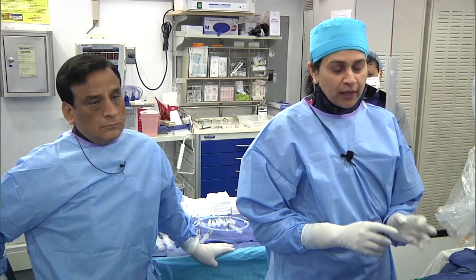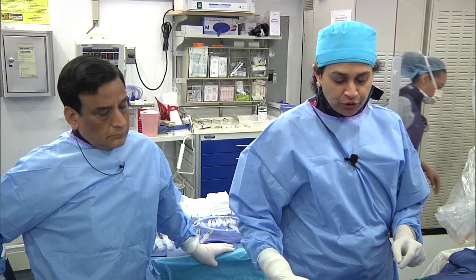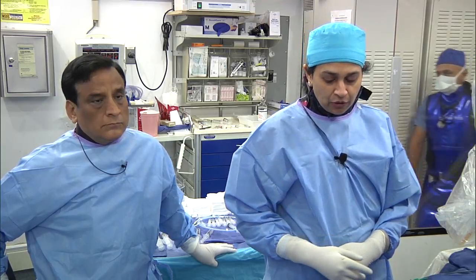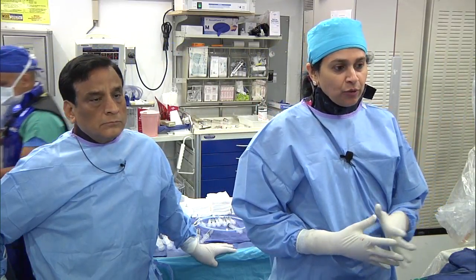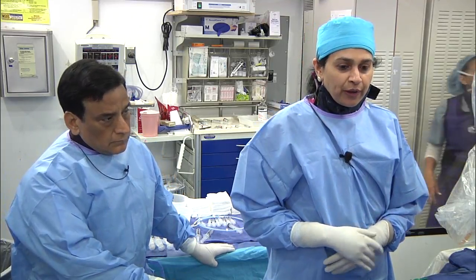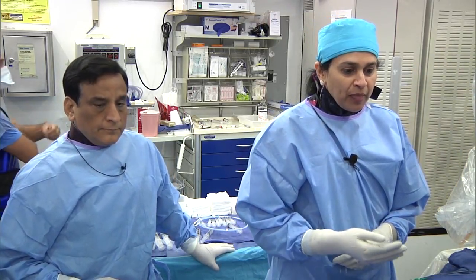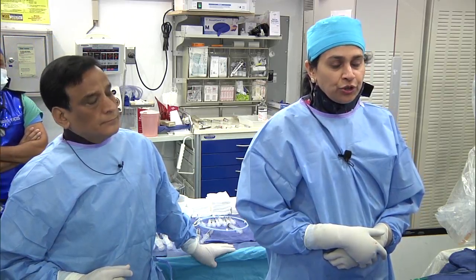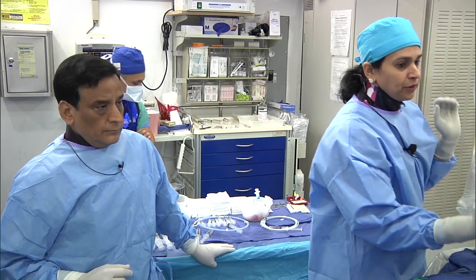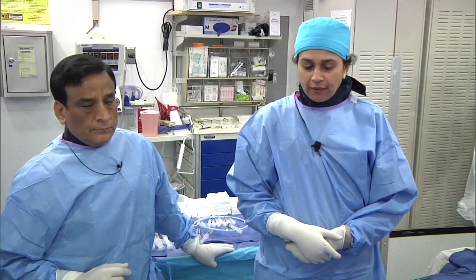Once you've gone through the septal, your goal is to get your Corsair, and you have to make sure you have the right Corsair because they come in various lengths. You need the 150 Corsair, not the 130 or the 135 Corsair. Once you are at the CTO level, you still use the same wire with the soft tip to see if you can go through the CTO. If not, then you try your other CTO wires. Usually go lower, which is Miracle 3 or something that will be able to go through. Very rarely do you need to go to the higher level CTO wires.